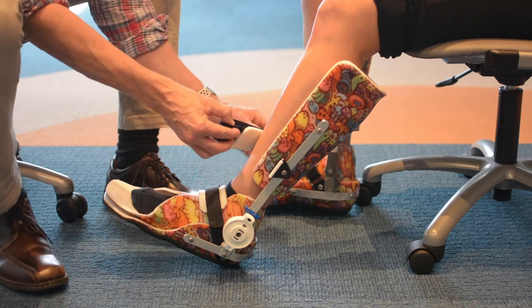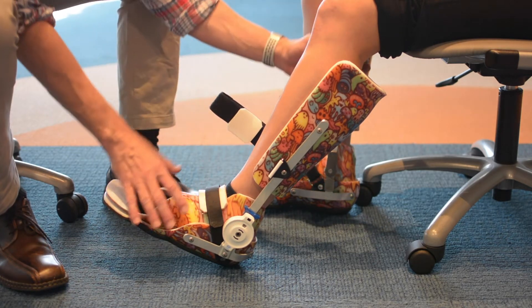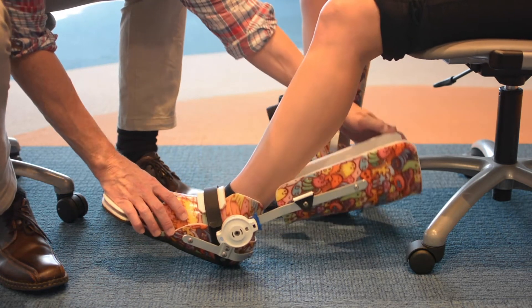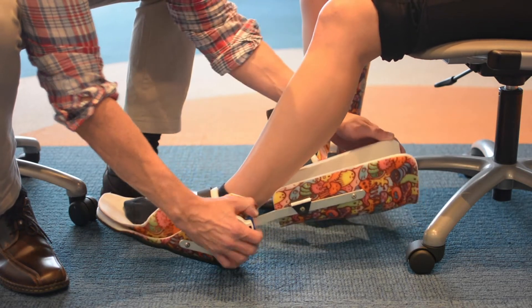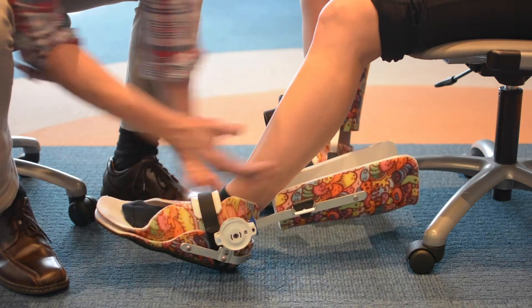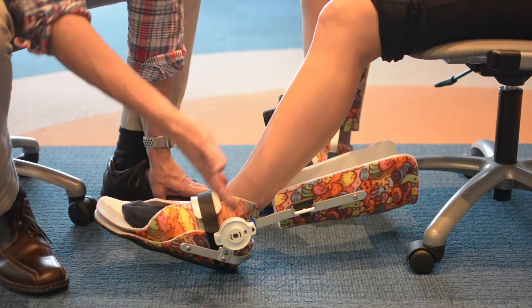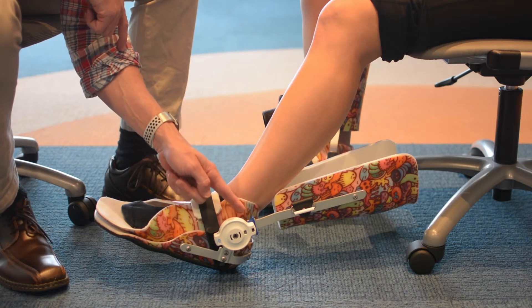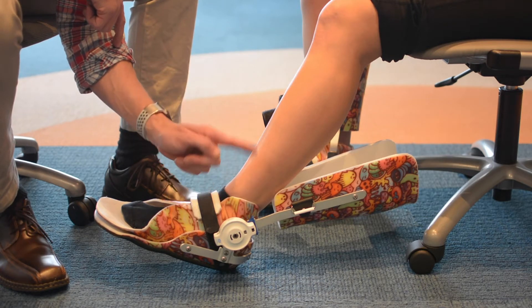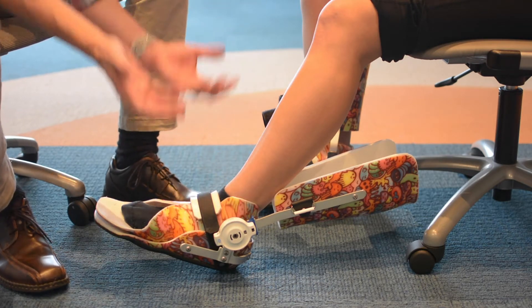Just go backwards from the way you put it on for those steps. Take this portion here and bring it way back so it's on delay. Then lock it, and you can just feel to make sure that it's not moving back up. Now it's locked and ready to go — remember that lock is just to help us put the brace on and take it off. It serves as an extra hand.